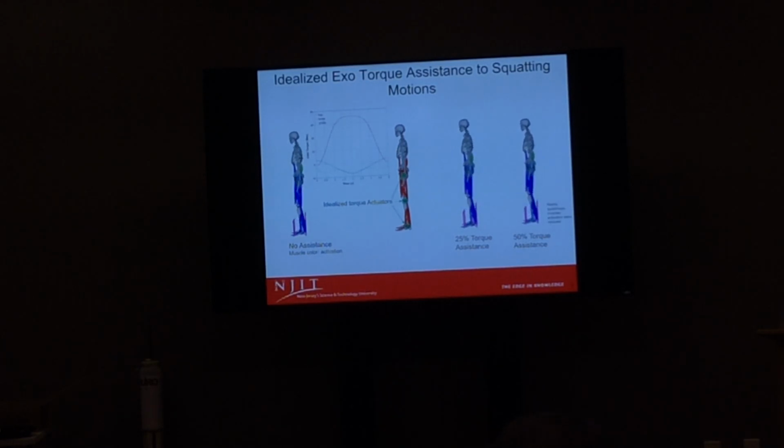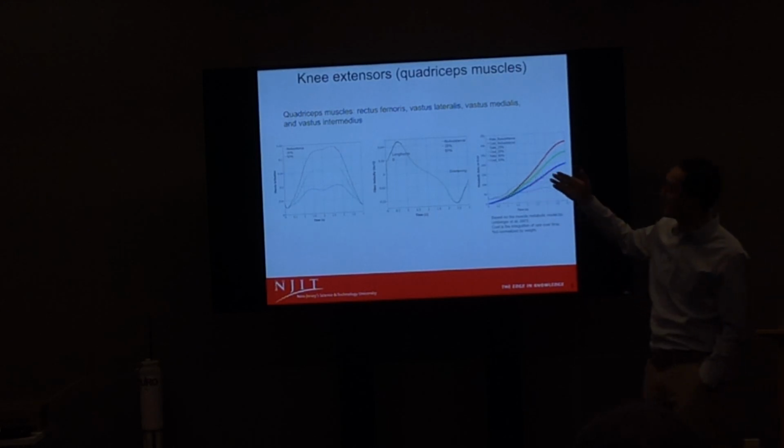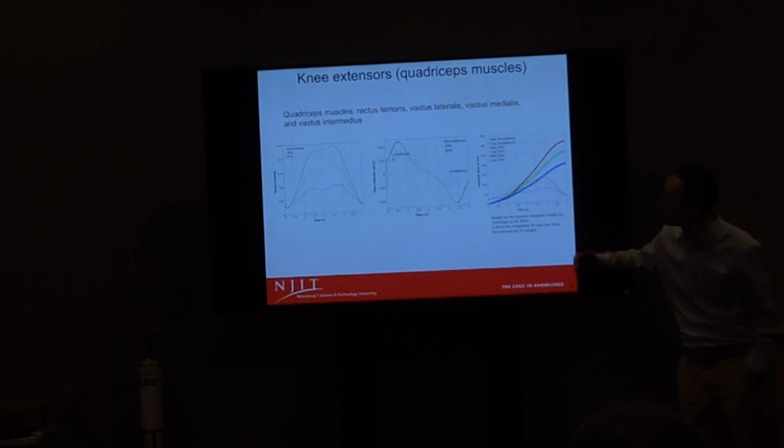The main thing we discovered is basically the quad muscle. Even in squatting, the quad muscle is the one affected most. You can compare the actuation: we start from about 25%. This is an average, because the quad muscle really is a group of muscles performing the knee extension. So it goes down from about 25% to maybe only 10% of the maximum.